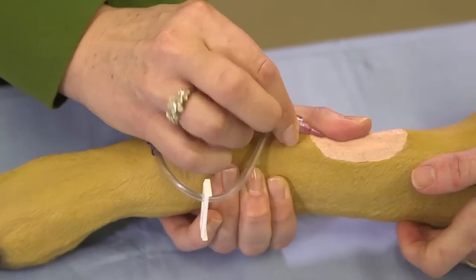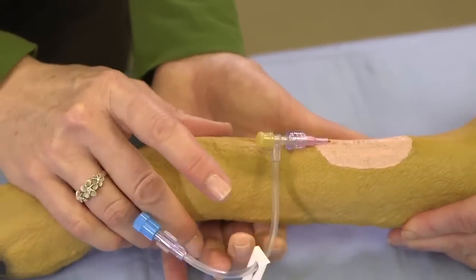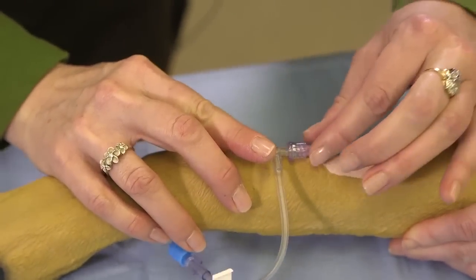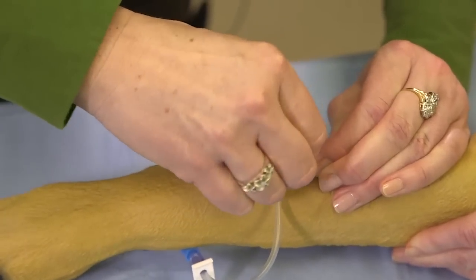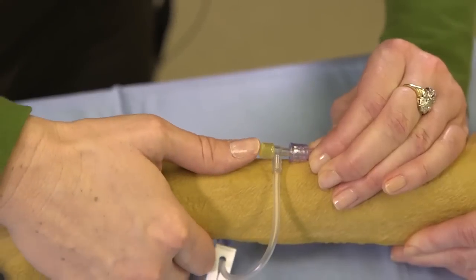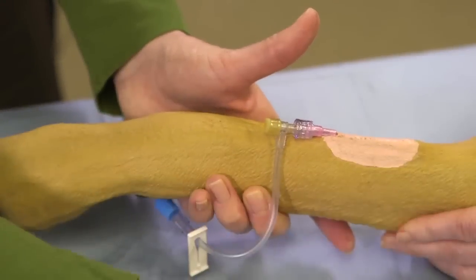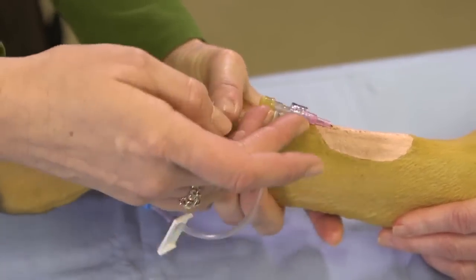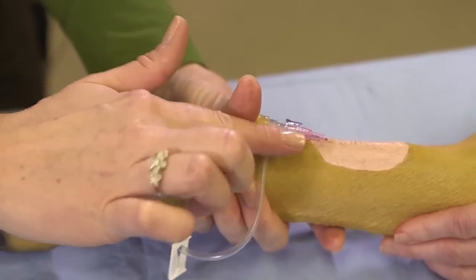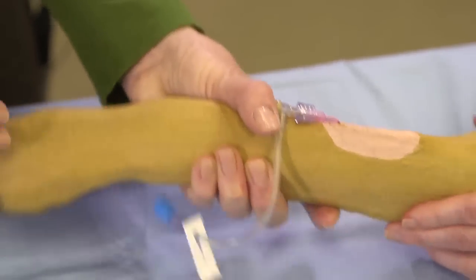This can be a little difficult. Once it's securely on and you've got good control of the leg, you can let go, grab your catheter end, and securely tighten. You want to keep this stable otherwise it may fall out, so grab your leg, take your thumb, and push forward a little bit so that it can't slide back. We've got good control here.